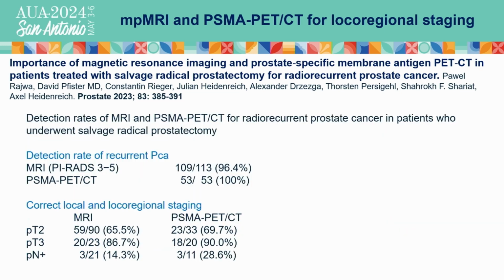When we look at the detection rates of the resected and recurrent prostate cancer, the PSMA PET scan is even superior to a multiparametric MRI to identify this locally recurrent disease. And the PSMA PET scan is also superior to the MRI to identify patients who have organ-confined or locally advanced disease. However, as in the situation of the initial primary staging in locally advanced disease, the PSMA PET scan still does poorly in identification of pelvic lymph nodes.